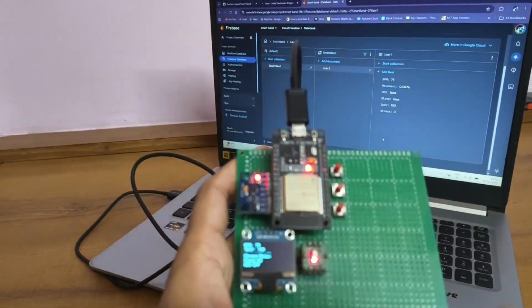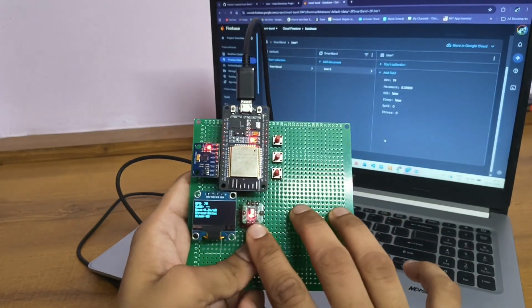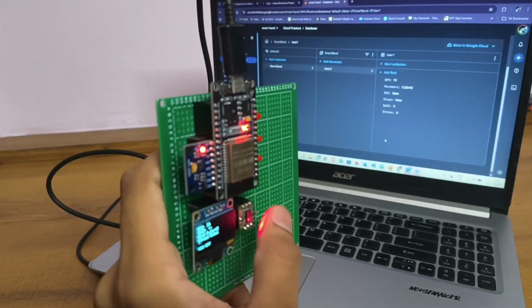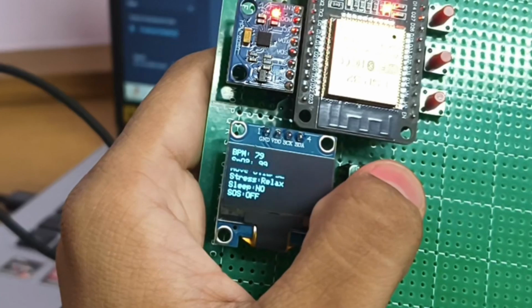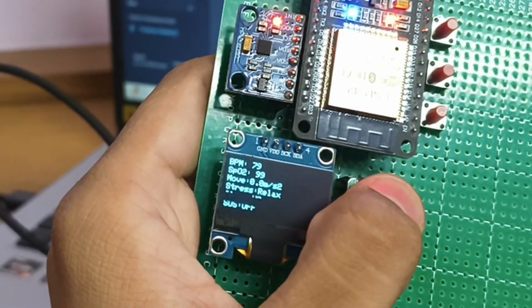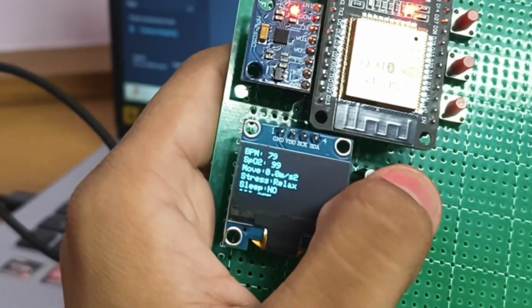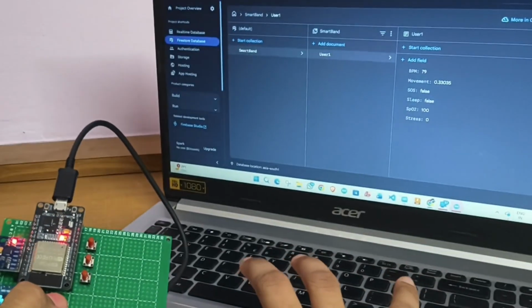In which I have used ESP32, MPU6050, the heart and SpO₂ monitor sensor, and an OLED display. All these sensors communicate using I2C protocol, which reduces wiring complexity. So when I click my finger on it, it shows the BPM, which is beats per minute, SpO₂, movement, stress, sleep, and SOS button. ESP32 is connected to my Wi-Fi.